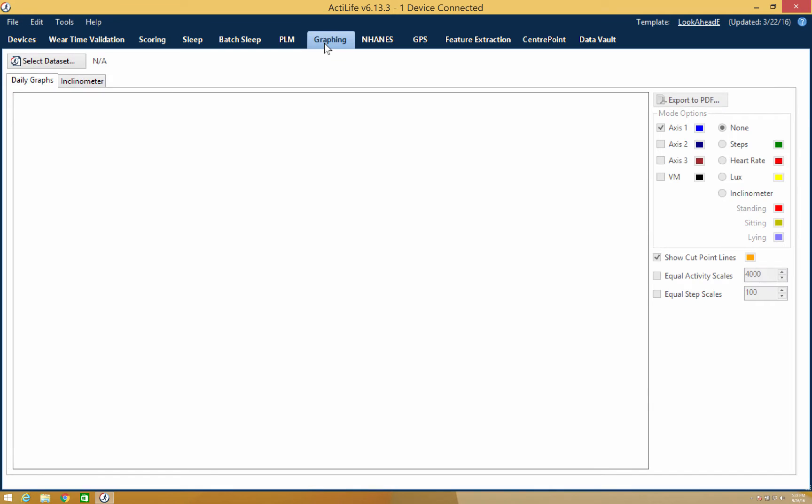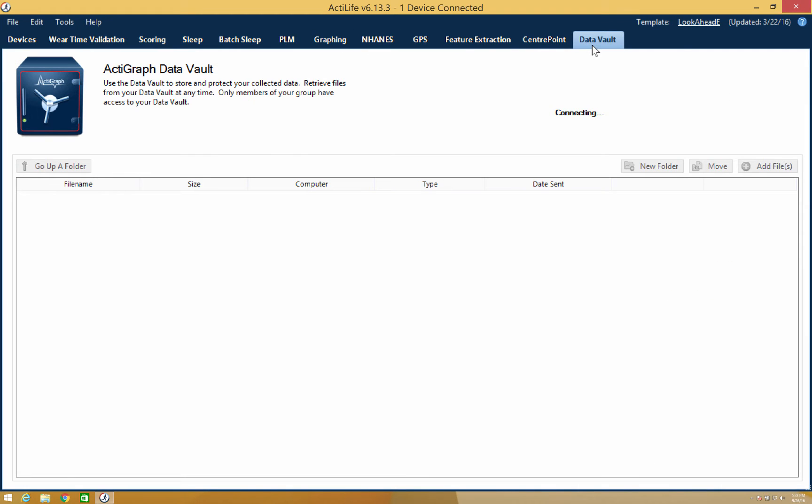Under Graphing, you can view a visual representation of the subject's activity in Data Vault, where data can be stored and shared between users.